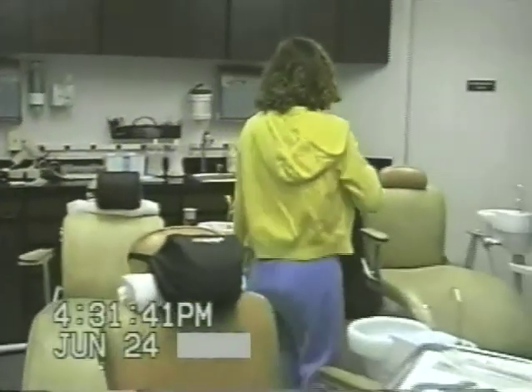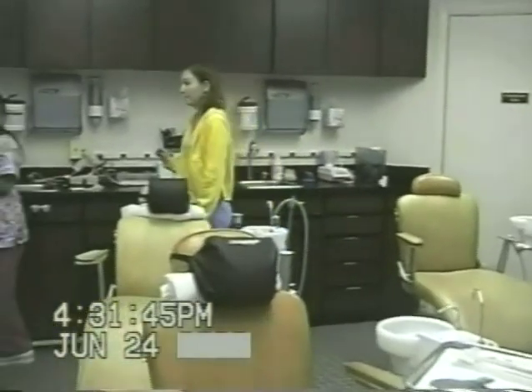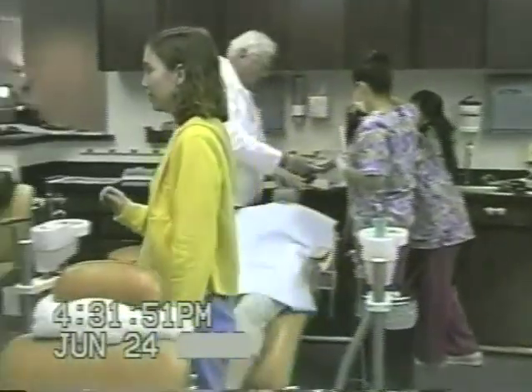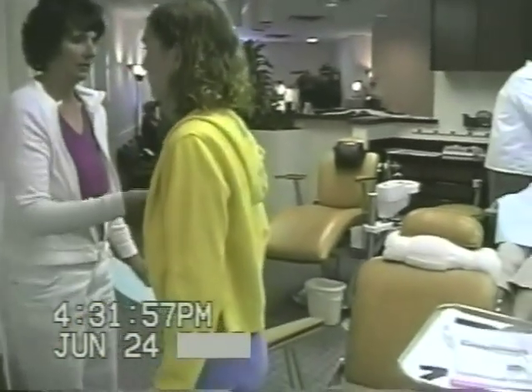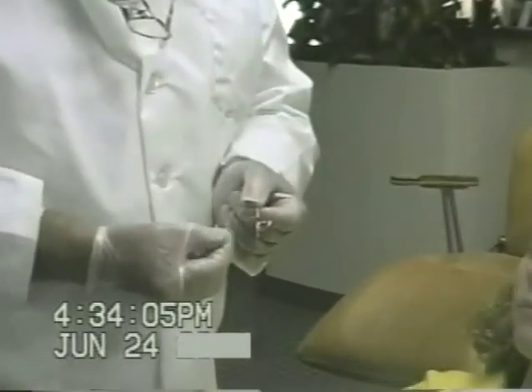The patient returns 4 days later without her wheelchair. I instruct her to walk around the office while we are working on other patients. Okay. Which chair do you want her in, Dr. Stone? Hold on. Notice she still does not use the left arm. We are going to insert her upper appliance today.